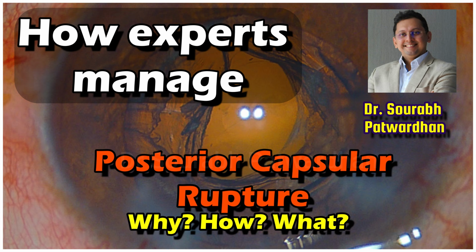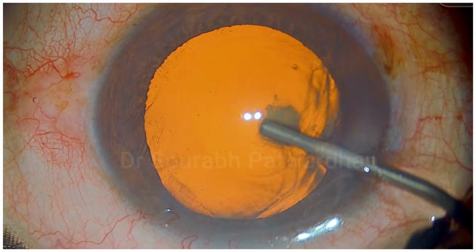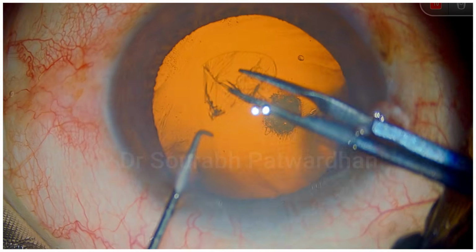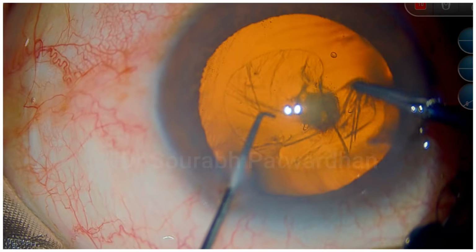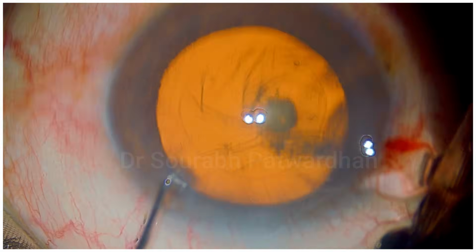In this video, I am going to show how experts manage a case of posterior capsular rupture. Also, at the end, do not miss why this posterior capsular rupture actually happened. So, this was a routine case. It's a posterior subcapsular cataract. It's not a posterior polar cataract. So, I didn't expect any posterior capsular rupture here.